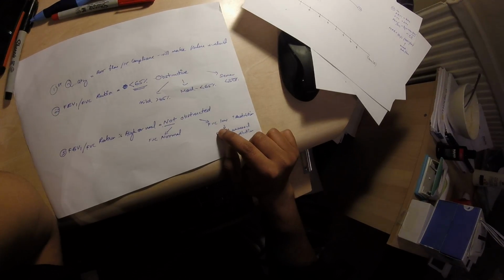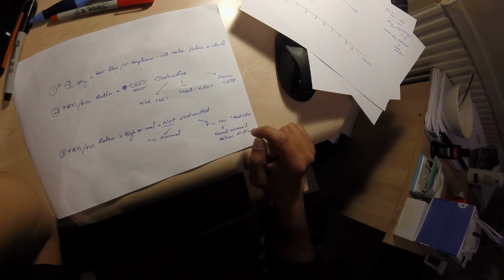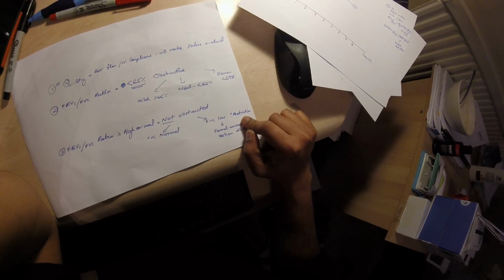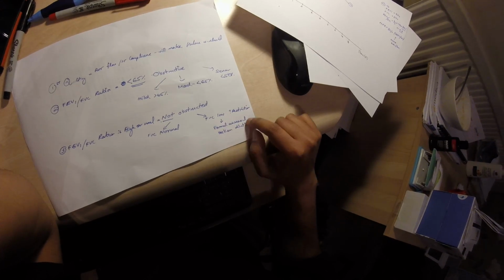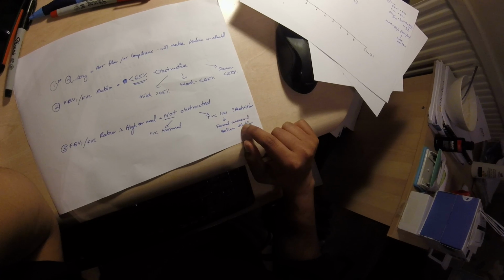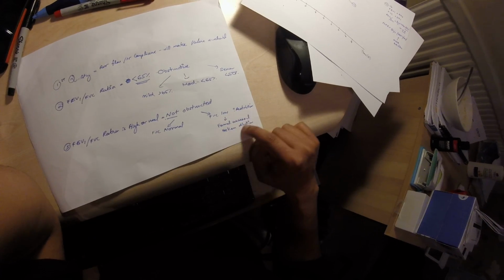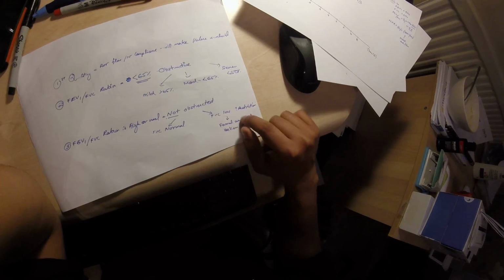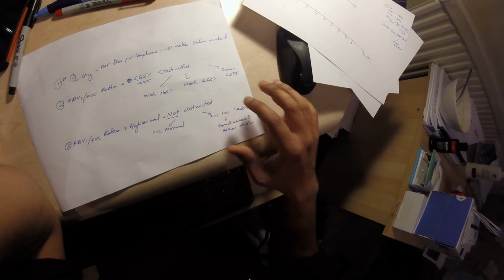If the FVC is low, it can be related to a restrictive picture, which will go down the route of assessing with a helium dilutional study or a plethysmography to help decide if it's a restrictive picture, which I haven't looked into.